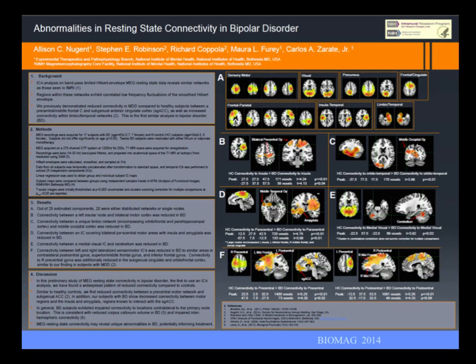What I really wanted to get to was that our focus now is moving on to doing connectivity. Given that we have this time sensitivity in the MEG, we can take our time envelope signals and use them to look at correlations between regions. This is a complex area of analysis because our signals are so much richer than the fMRI ones. The kinds of things we can look at as a surrogate for connectivity between regions is much larger. We can look at power correlation, phase modulation, all sorts of things. So it's a bit of a trick to sort this out.